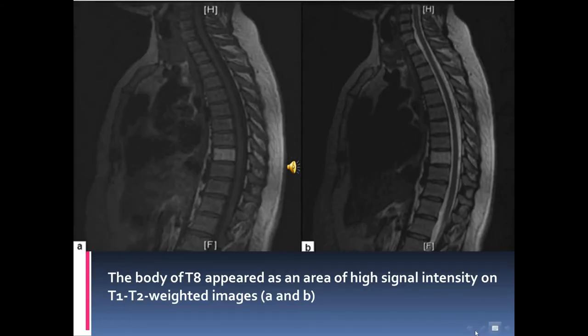Here in this slide, we can see the MRI of the hemangioma. You can see abnormal signal intensity of the T8 vertebral body, as high signal intensity on both T1 and T2 MRI study. Of course, this is a sagittal view, and you can see the abnormal vertebra well delineated in MRI. So, you can know that the image on the left is the T1 because the CSF is low signal, and the image on the right is T2 because the CSF space is high signal intensity.